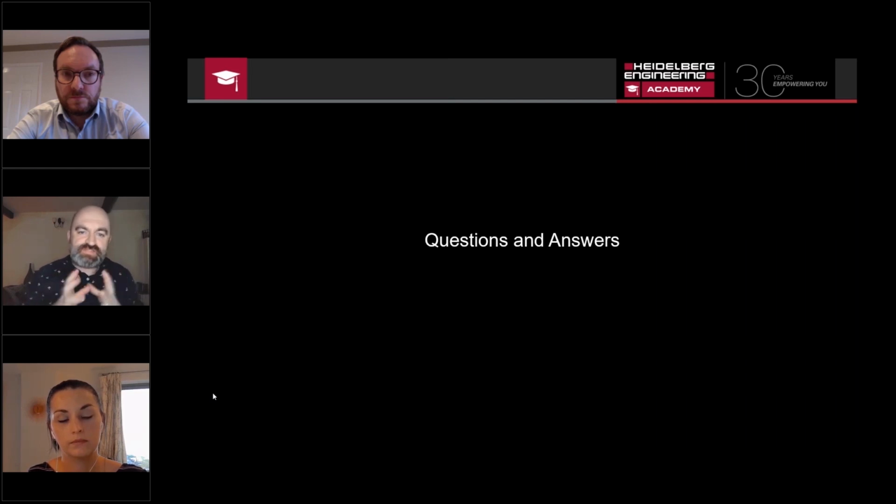It's a set of parameters, and if you're interested in the exact details, we can email you the normative data information. But I believe there's no one more than, I think, -2 or +2 on these databases. So when it comes to older, thinner, strange shaped retinas, it's more challenging.